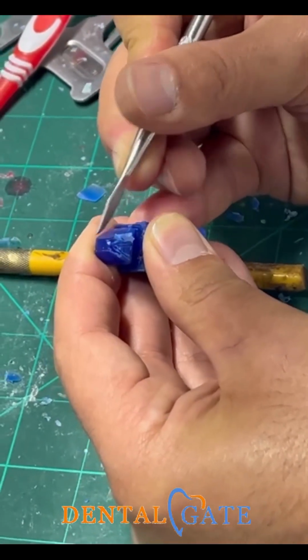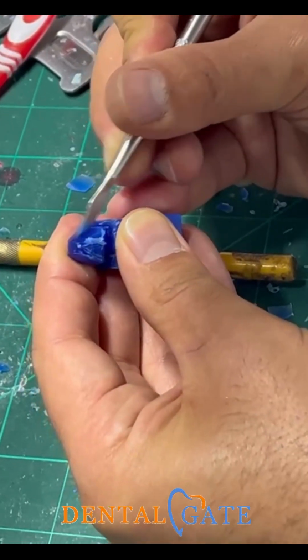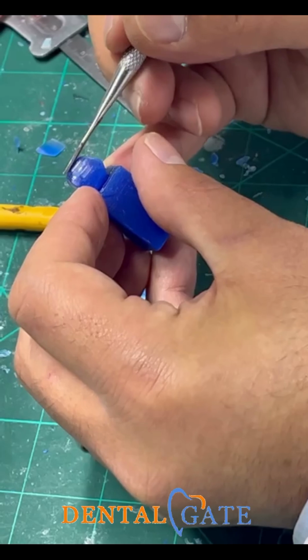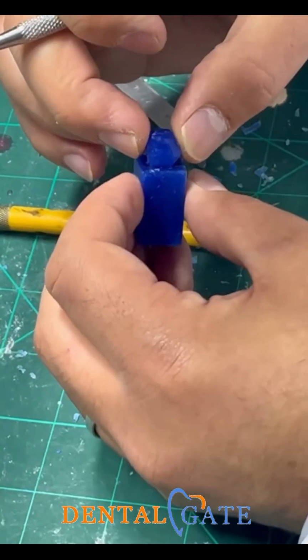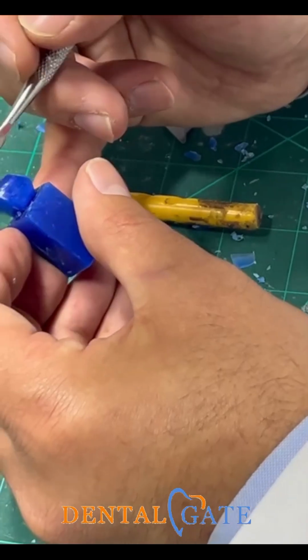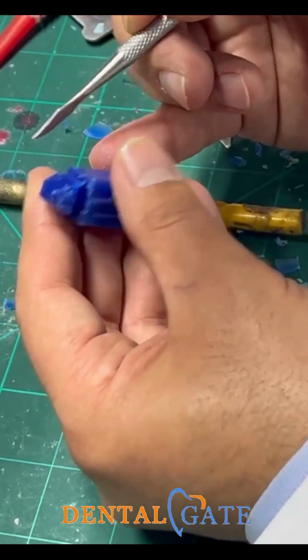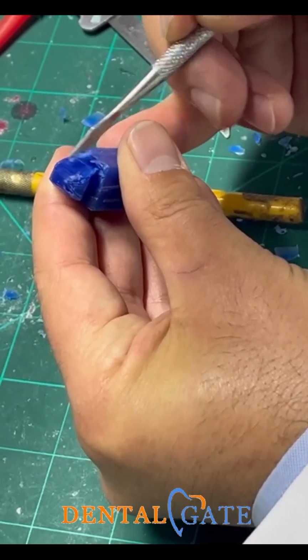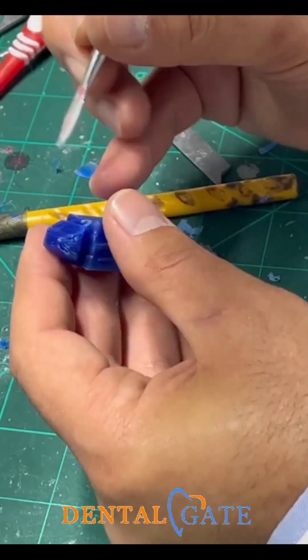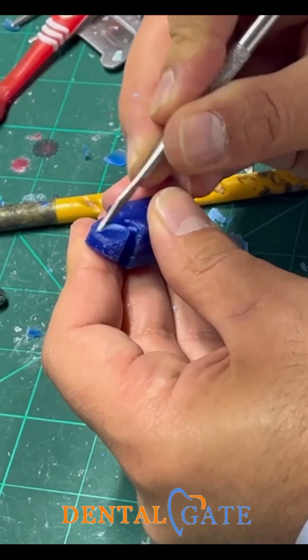Now I will make the lingual, make a slicing here, but please preserve the incisal edge, because we have a short span of the incisal edge at the lateral incisor. Don't remove severely from the lingual or from the incisal edge.